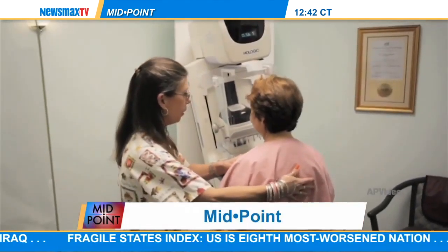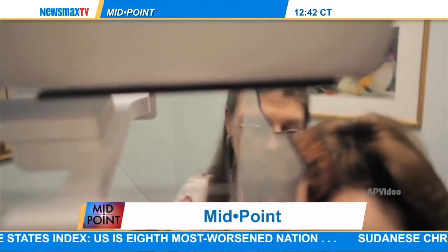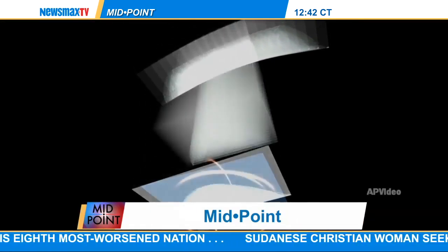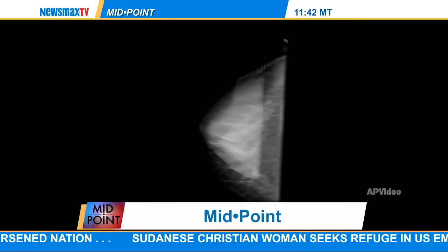If you think about the difference between 2D images, Disney cartoons from the 50s or the 60s, say, compare them to Avatar. The visual is much better. You can get that 3D. You can see everything from various angles, and what that gives radiologists and doctors is a better look at a breast where they're not sure. Particularly with younger women, it's harder to tell whether something that looks suspicious like cancer truly is cancer.